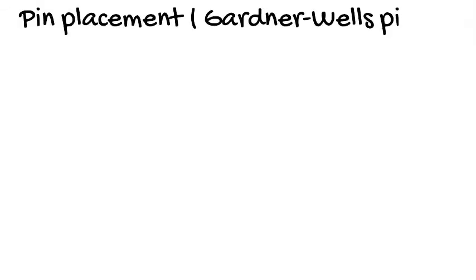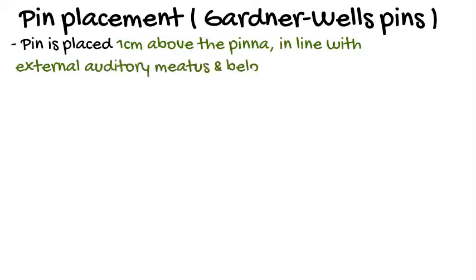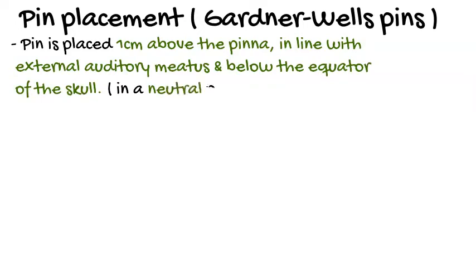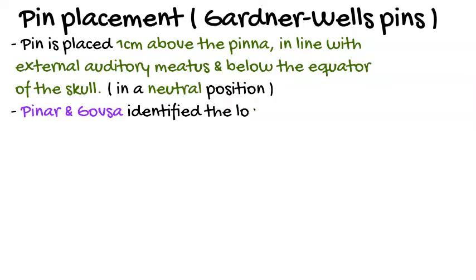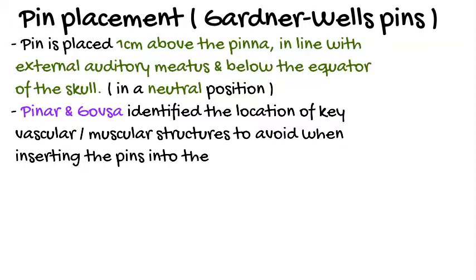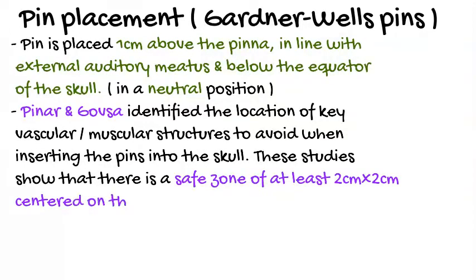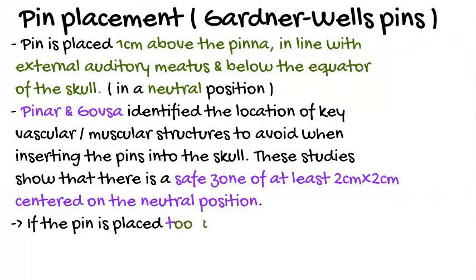What is the area of pin placement in Gardner-Wells tongs? Okay, this is one of my exam questions. The pin is placed 1 cm above the pinna, in line with the external auditory meatus and below the equator of the skull in a neutral position.